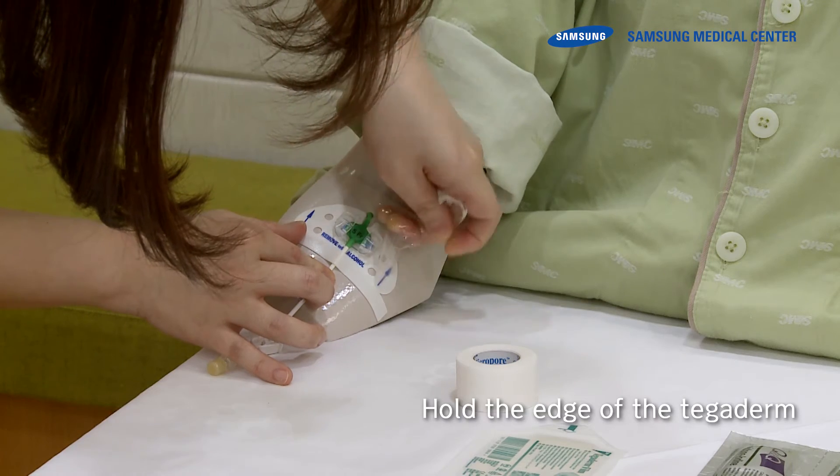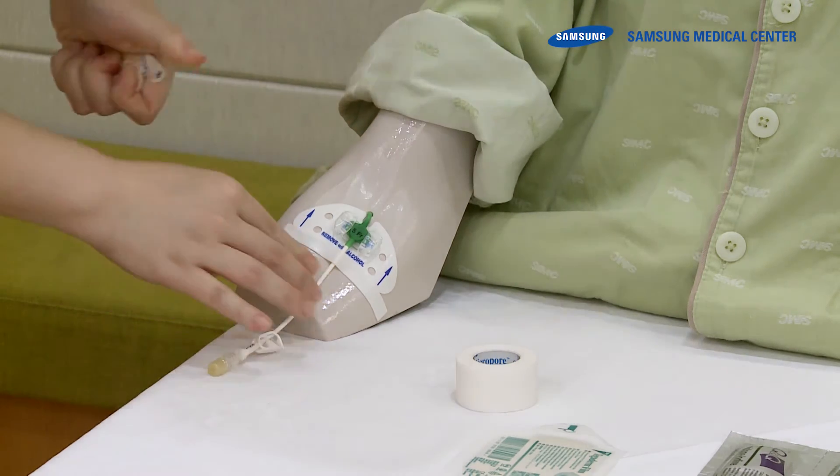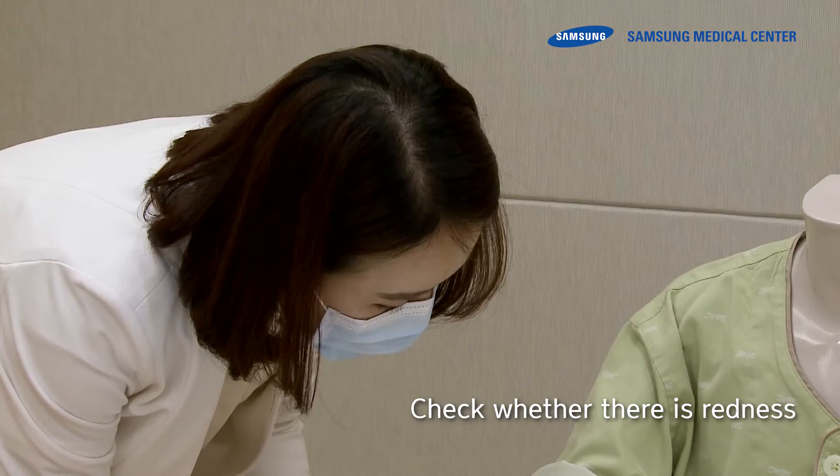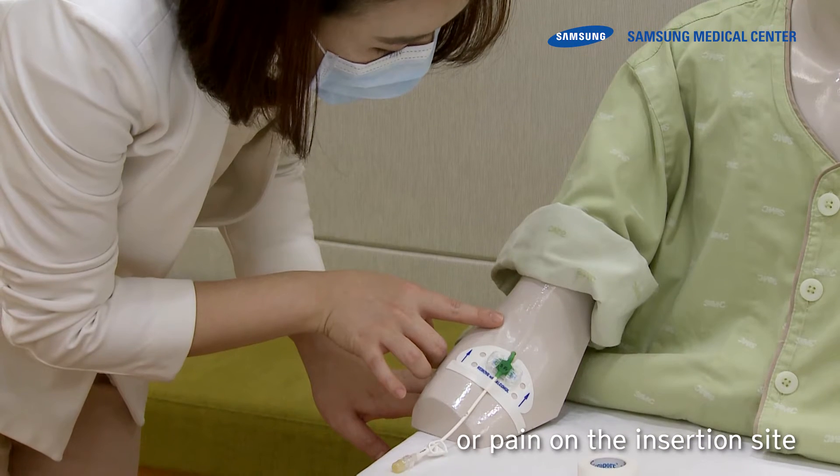Hold the edge of the Tegaderm and lift it upward. Then check whether there is redness, edema, pus, discharge, or pain on the insertion site.